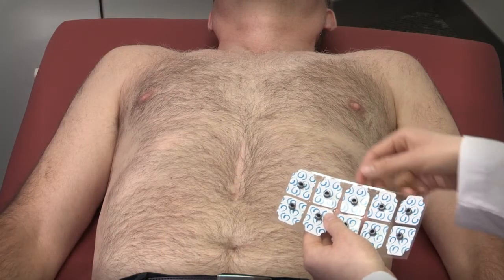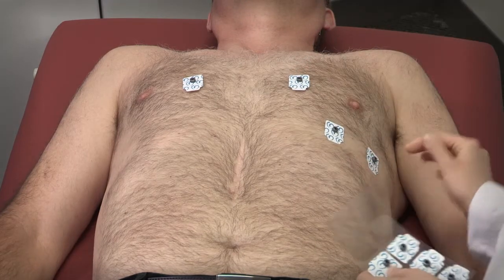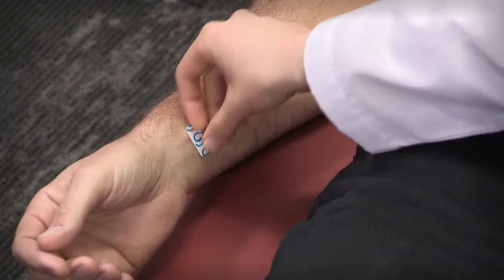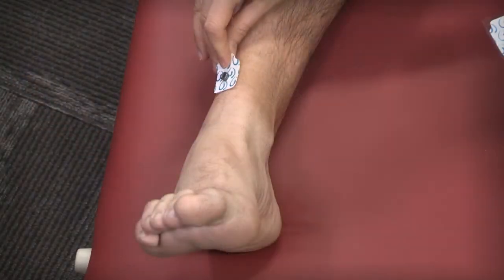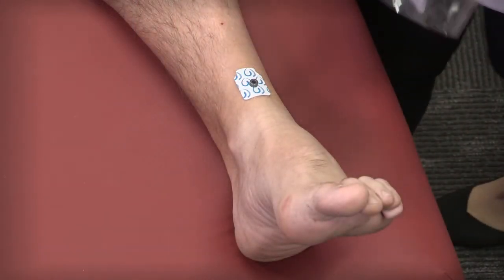Place the MyoVista center post electrodes according to standard IEC or AHA protocol. Be sure to press firmly to ensure strong connection. The MyoVista device is a resting 12-lead ECG. There is no change in electrode placement protocol.